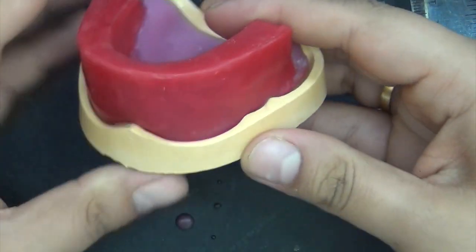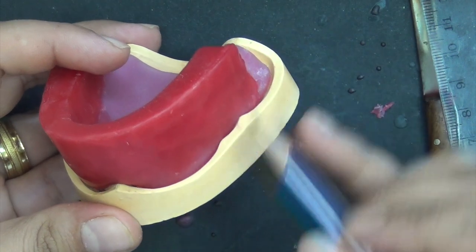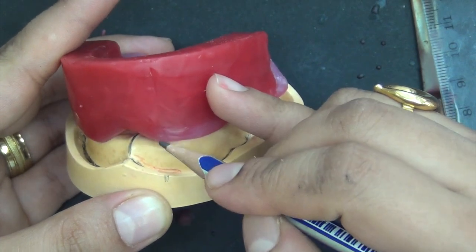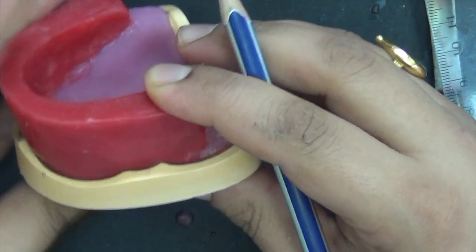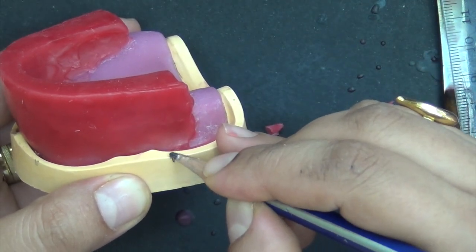Mark the points where you're going to take the measurements of the height of the occlusion rim. Buccally, we're going to take it distal to the labial frenum, and you're going to mark it on the cast and on the rim itself. Now do the same for the buccal frenum.